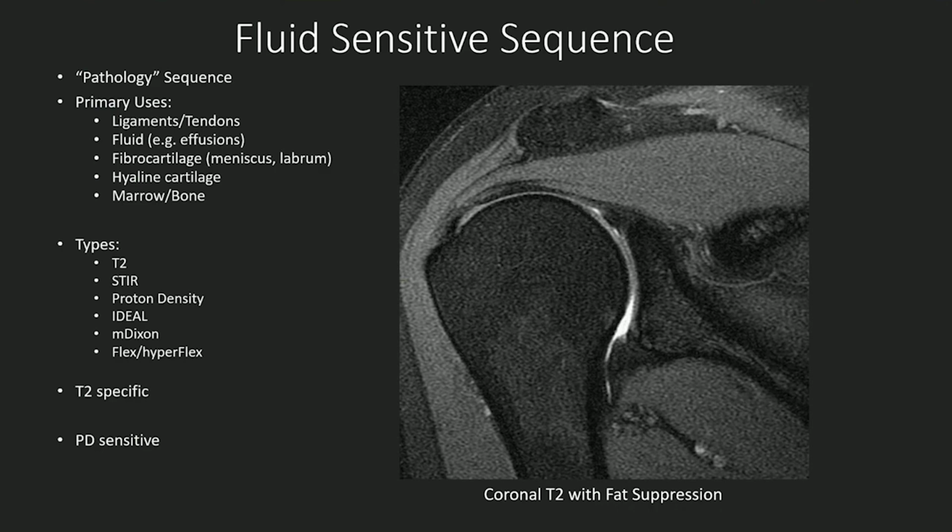When we look at an image, say in the sagittal plane to evaluate a meniscus, if we see signal in the meniscus that touches an articular surface, it could be the superior or the inferior part of the meniscus, on a single image, that actually has a low sensitivity and specificity for a tear. It's around 30%, I believe, in the lateral meniscus, and slightly higher in the medial meniscus. However, if we see that bright signal going to an articular surface, superior or inferior, on more than two images, that has a very high sensitivity and specificity.